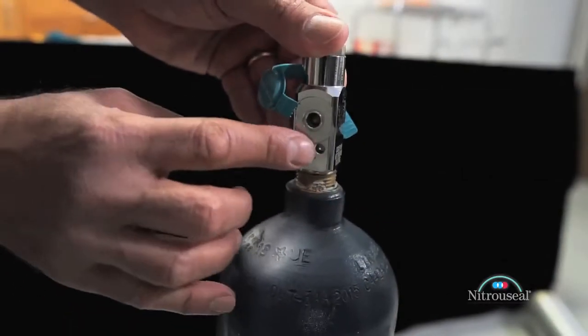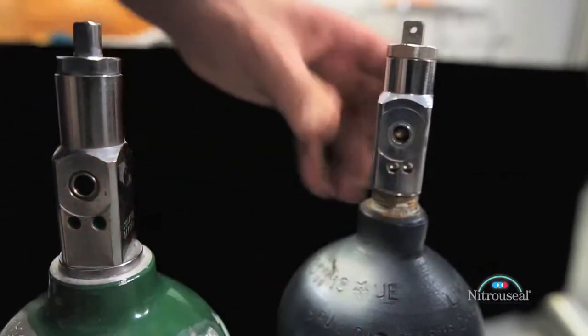Removal of the cap exposes the cylinder connection pins, which are different for each type of gas. This assures that only the correct gas cylinder, oxygen or nitrous, can be connected at its appropriate location on the manifold bracket.